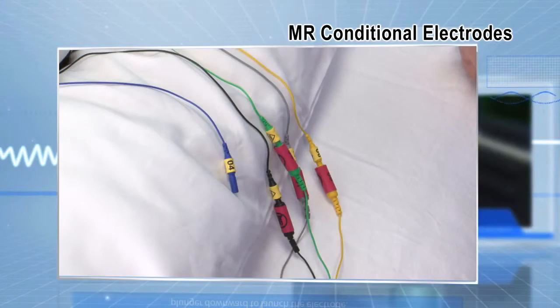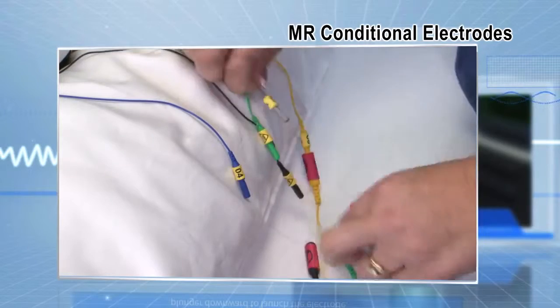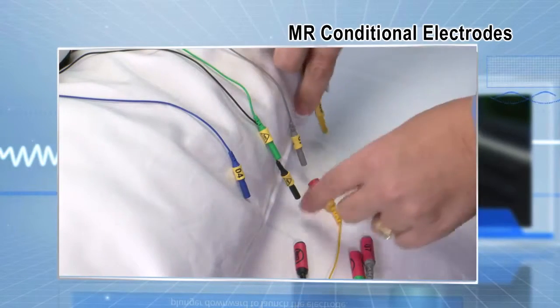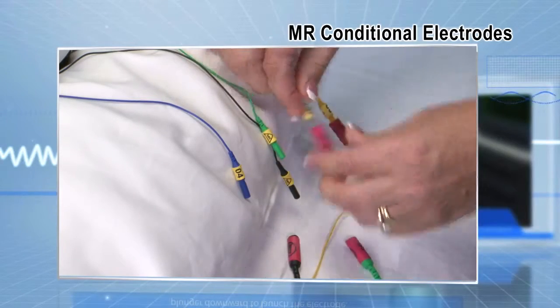When the patient goes to the scanner, simply disconnect. Upon return from the MRI, reconnect using numbers and colors to ensure accuracy.